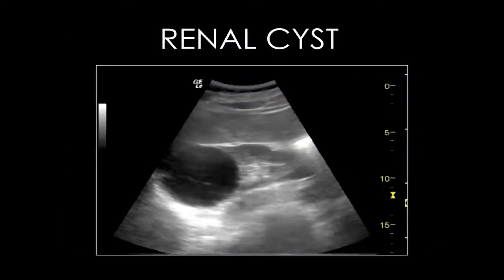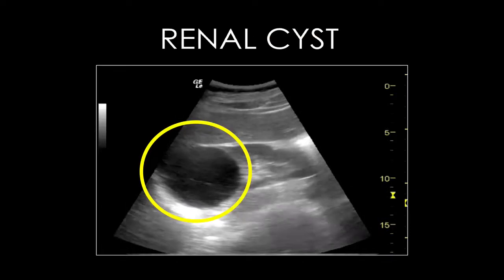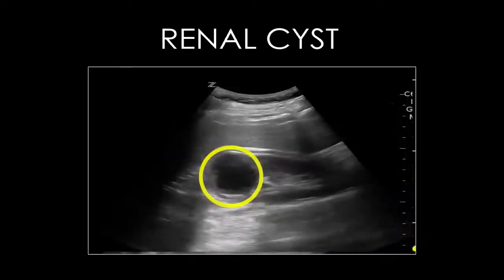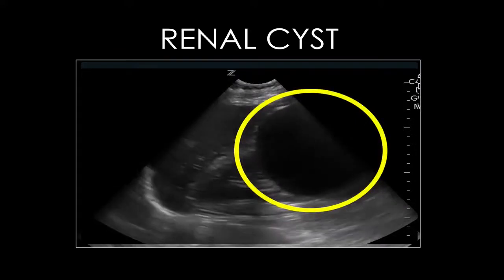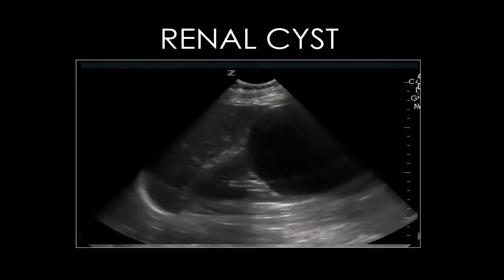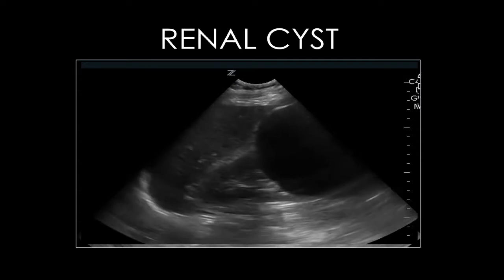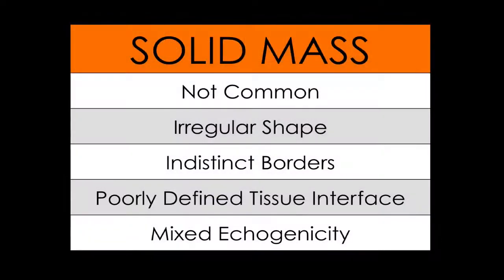This video is a longitudinal view of the right kidney with a simple cyst at the superior pole. Here is another simple cyst within the kidney. Here is a very large renal cyst; however, typically these do not bother patients and most of these masses are of little clinical significance. Solid renal masses have ultrasonic characteristics which are distinctly different from renal cysts. They are not common, they have irregular shapes and indistinct borders, there is a poorly defined interface within the renal tissue, and the sonographic appearance has mixed echogenicity.